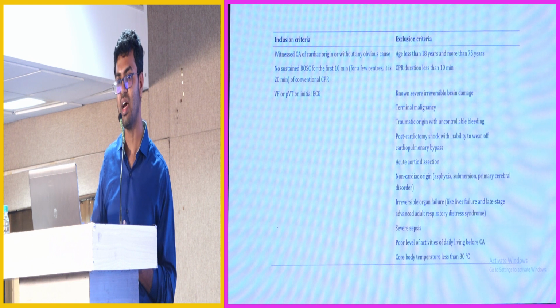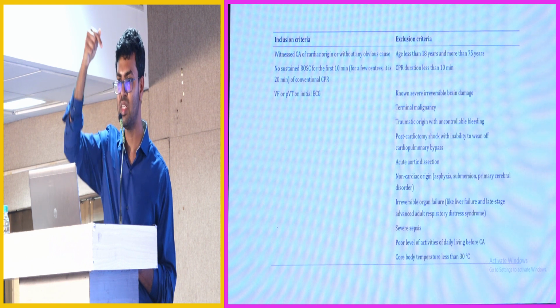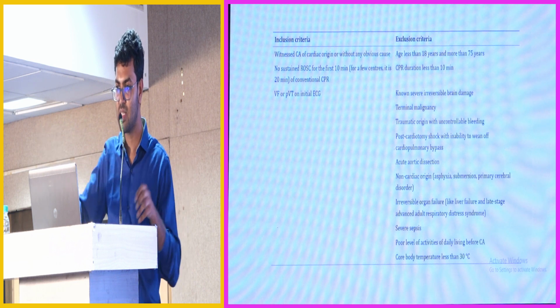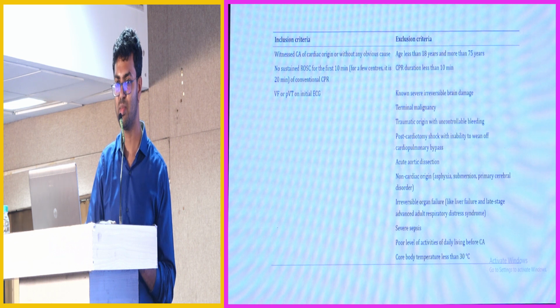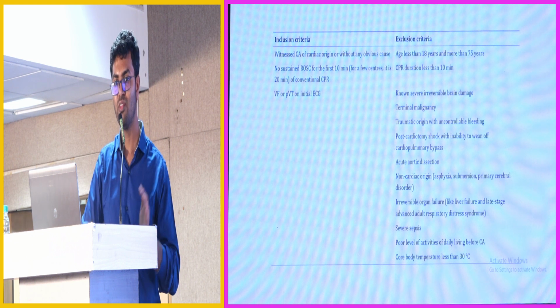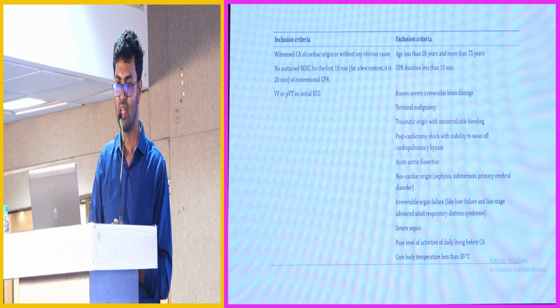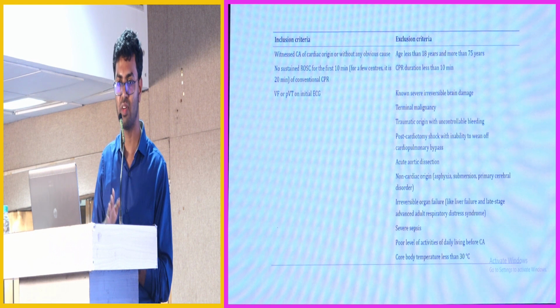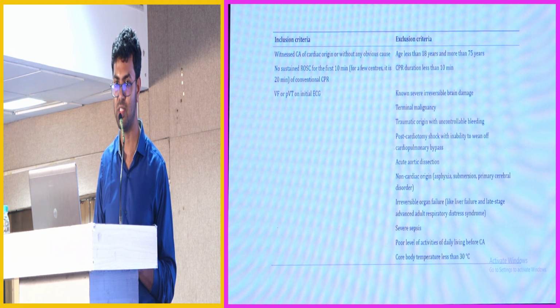Impella is an IABP-like device, but there is a motor at the end of the tip which sits in the LV, collects the blood from the LV and pumps it to the aorta. So we placed Impella in this patient, then slowly weaned off from the VA ECMO. Then Impella was also weaned off after a few courses of steroids, because she had a viral cardiomyopathy.